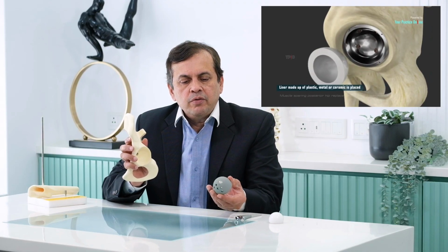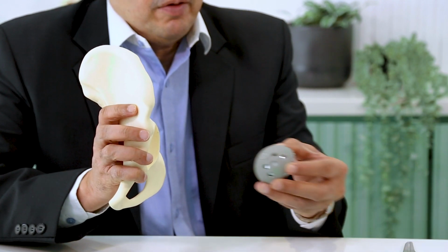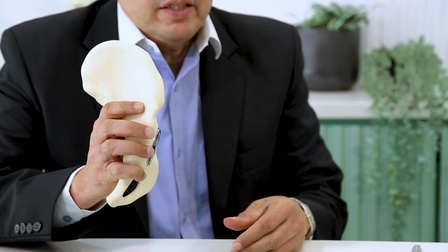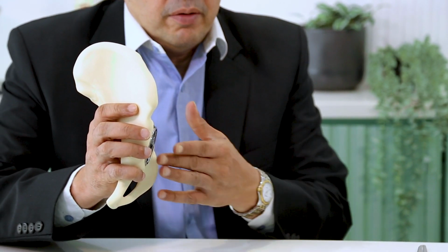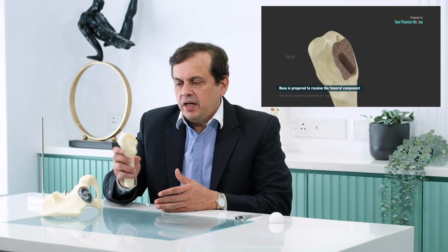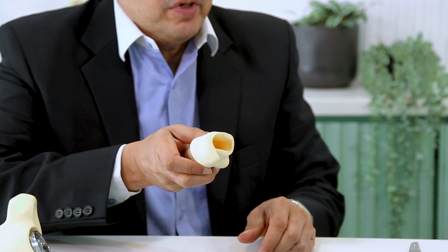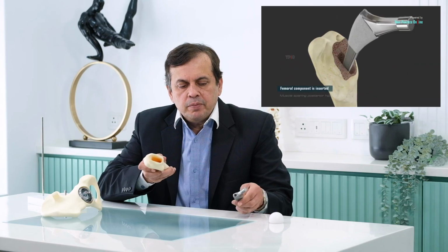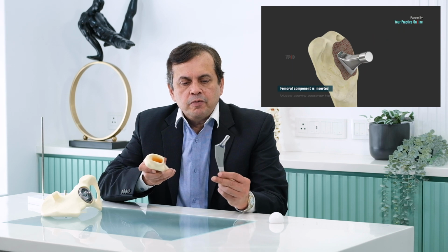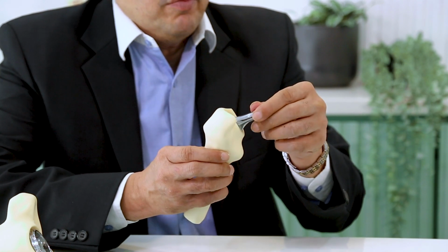On top of that, we put in an artificial joint, which is seen like you can see a half circle, which is coated with special material. Now this cup is put inside the joint like this, so this becomes your metal cup. And on top of that, now we have to prepare the thigh bone. So once your thigh femur is prepared, the canal is prepared, as we see here, with different size of material, and after that we have a special design of different sizes of what we call femoral stem. This goes inside the femur and it holds the thigh bone properly.